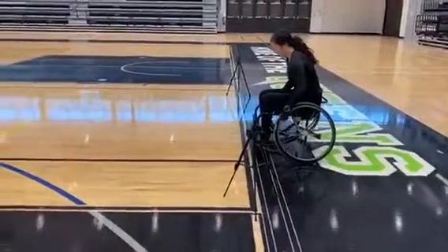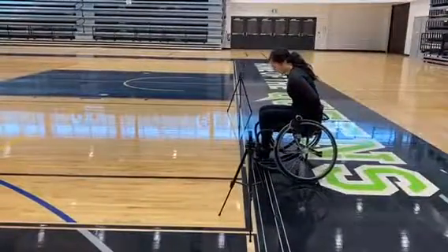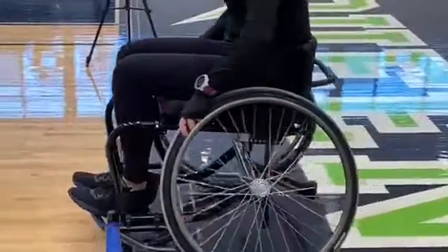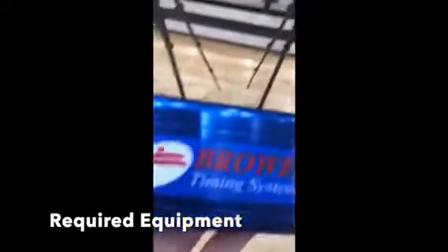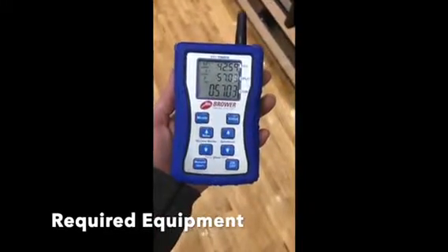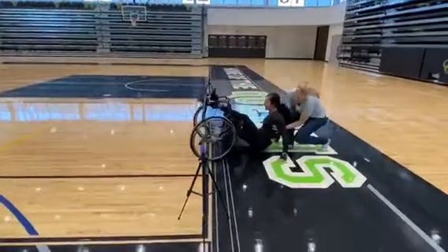In order to complete this test and to get the most accurate data, it should be performed on a flat, hard surface. The equipment required to run this test includes a tape measure, timing gates, and a way to calculate your time. Lastly, the most important, the wheelchair.